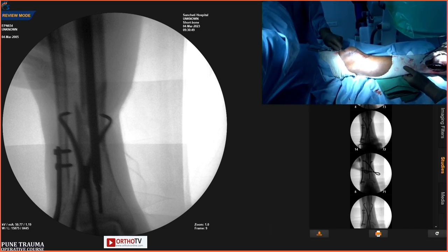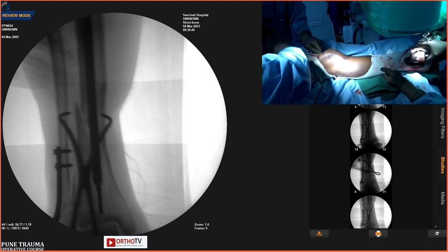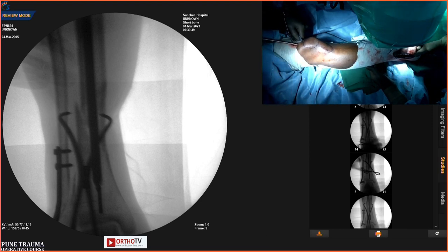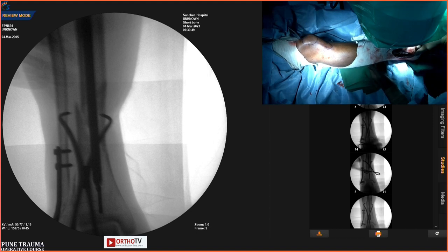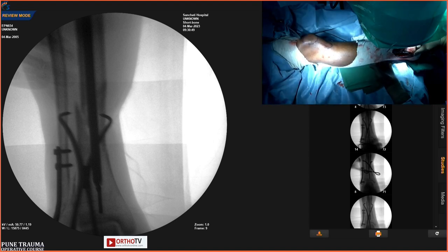Here what has happened, sir: actually the reaming system is not a single unit here, and therefore we are using a separate reamer. If it's a single reamer without a changeable tip, you are perfectly right, sir. I would always prefer a guide wire which has a bead right at the end, so you don't need to change it.